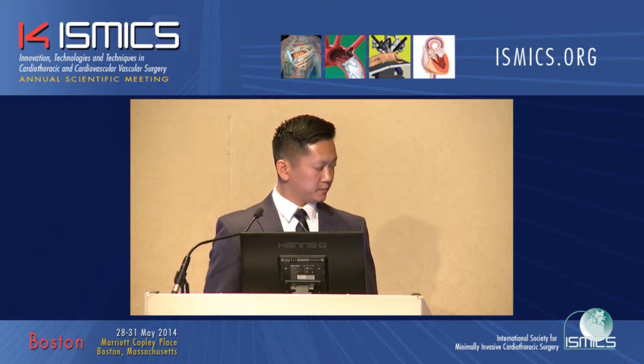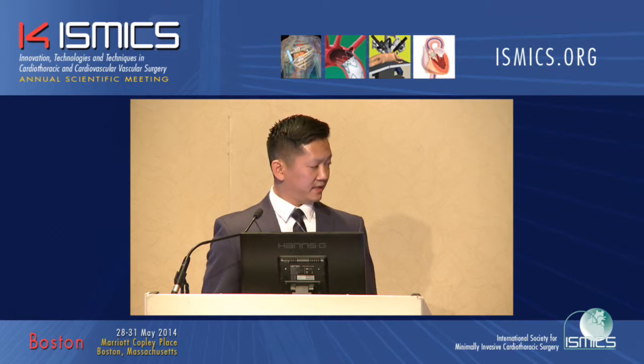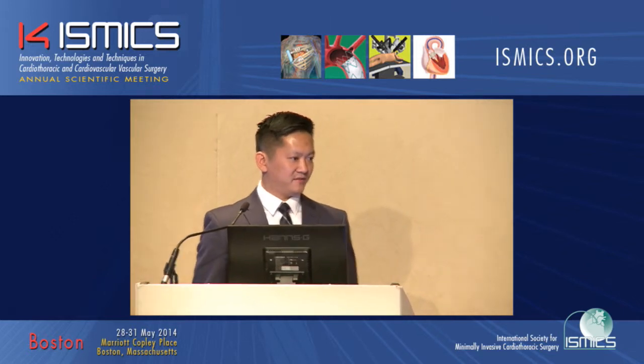The American College of Surgeons this year recommended that at least 10 lymph nodes be counted in the specimen. What was the number that was counted? We didn't look directly at that, unfortunately, but it would range sometimes from 5 to 20.